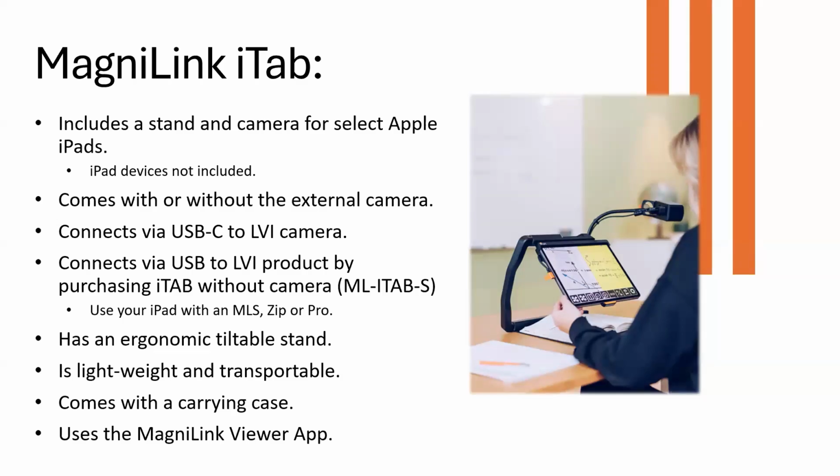Also, today we're going to be showing AI, and if you're not connected to one of our cameras, the AI portion of the software is not there either. So you have to be plugged into one of our cameras to get the new AI feature.